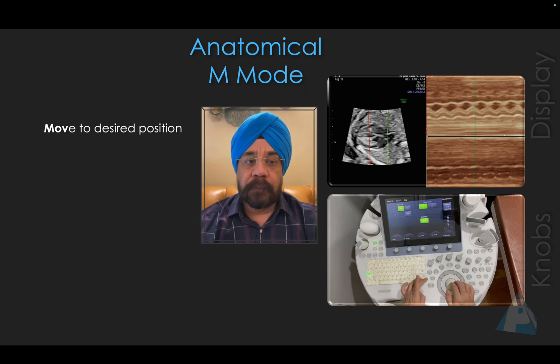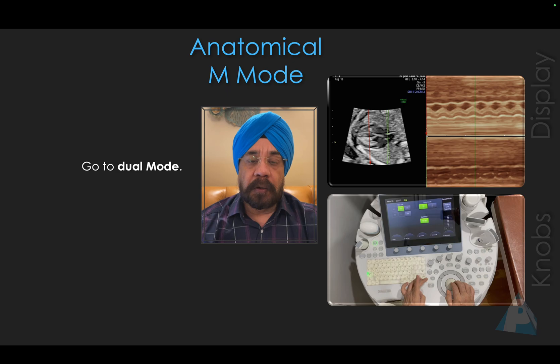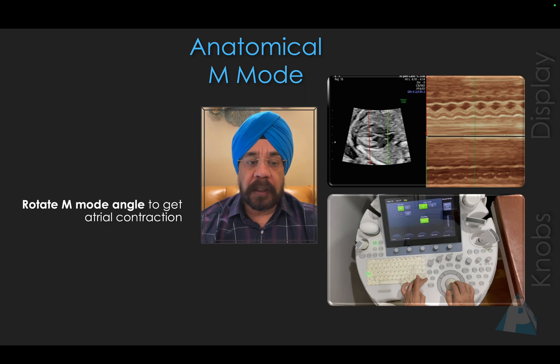Click M-Mode, then move the cursor to a specific position. Then rotate the M-Mode to get a better contraction — first you capture the contraction of the ventricles. Then go to dual mode, which activates another M-Mode. Take that second M-Mode to the other chamber, such as the atria, and perform the same sequence — rotate and move to get the best atrial contraction.